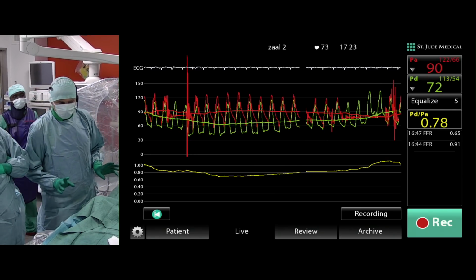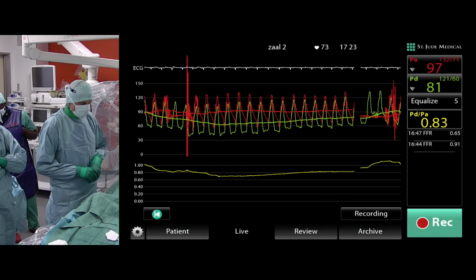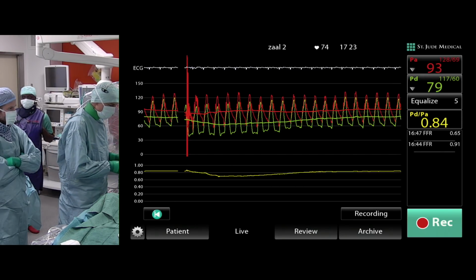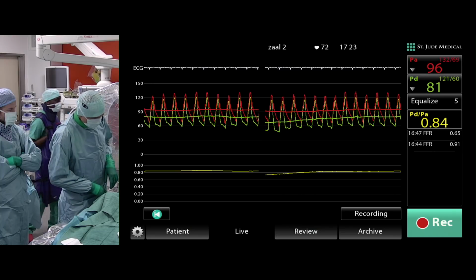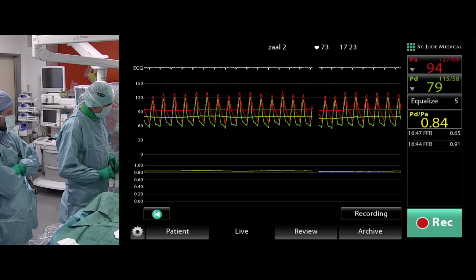Whatever you inject in the coronary artery, especially when there is a little bit of contrast, but also saline, induces hyperemia. But the lesson is, if you use papaverine, which is very convenient, it can be given intracoronarily, please be careful, flush all the lines with saline. It's not rocket science, but it's important.